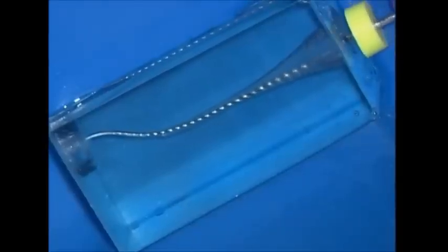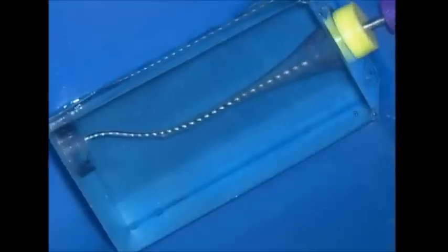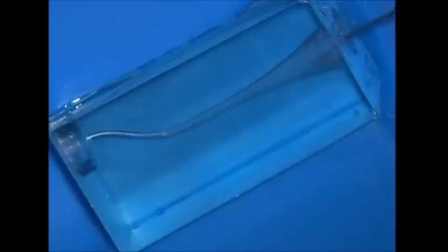With improved access, the small pre-curved hand file is free now to go to length. It's worked repeatedly in short amplitude strokes until it is loose. Irrigate and recapitulate and re-irrigate. Well, we've worked a 10 and 15 hand file to length until they were loose, but the ledge is still present. Let's look at ledge management.